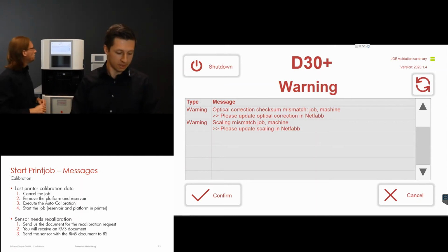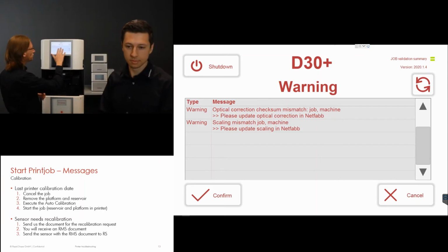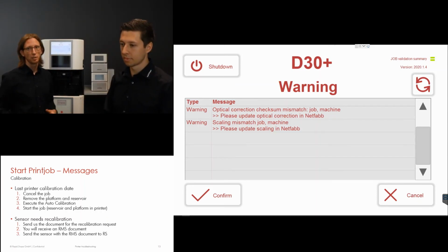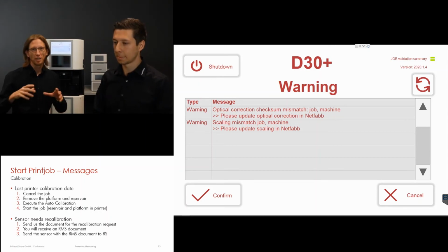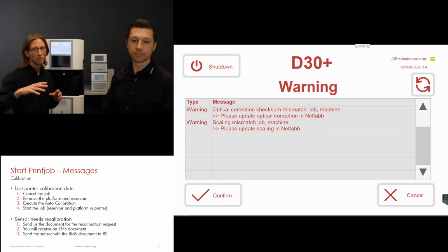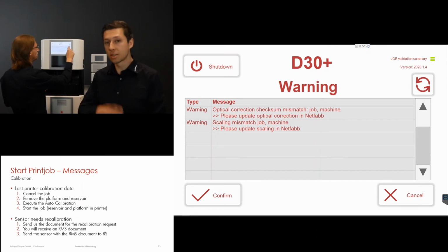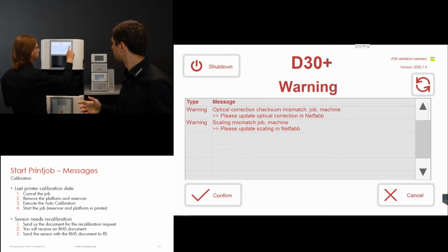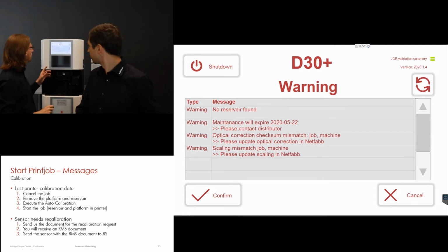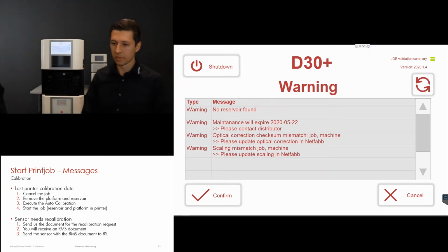All right. So what we got here on the screen is still the same as what we already discussed. Right now we have optical correction, checksum mismatch, as well as the scaling mismatch. What you can see here can be a little bit confusing, to be honest. We can see just the lower part of the warning messages. Just scroll up to see all the messages on the screen. Yeah, it depends where you left the last job. Thank you. As you can see, we still have some messages on the screen. Let me fix that quickly by inserting a reservoir.